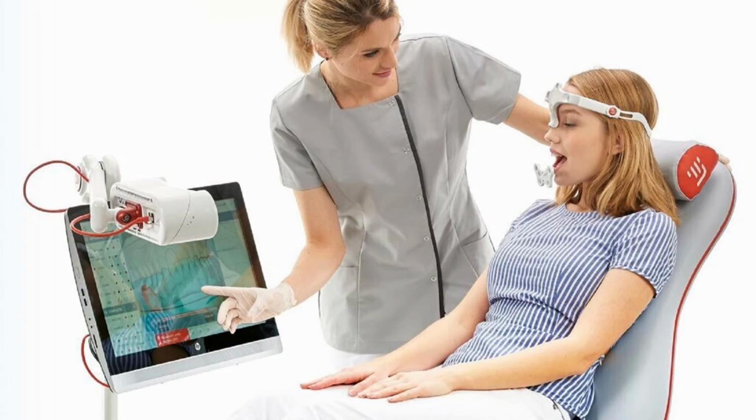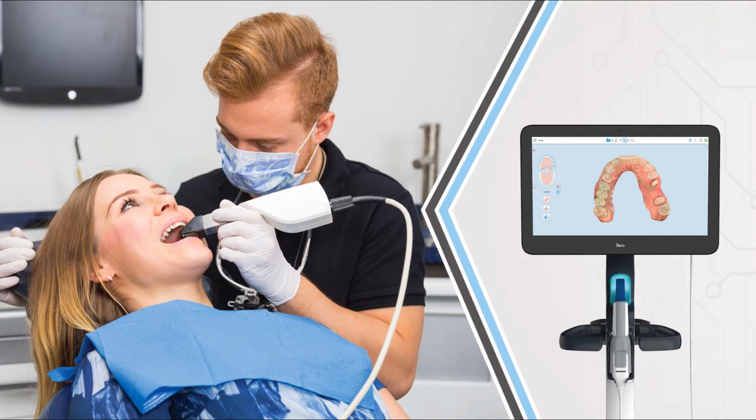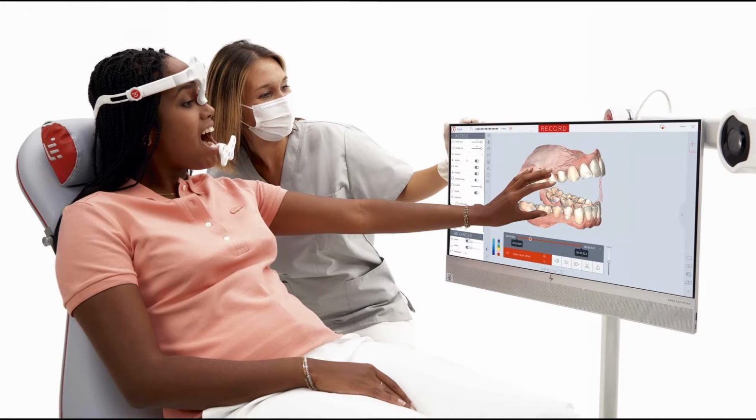Computers are used in radiovisuography, RVG, technique, clinical diagnosis and treatment planning, storage of patient photographs, radiographs and study models, computerized imaging techniques, computerized cephalometrics and growth prediction. Digital radiography can be stored on the computer easily and can be transferred to different dentists or orthodontists for referrals. It reduces radiation and time.